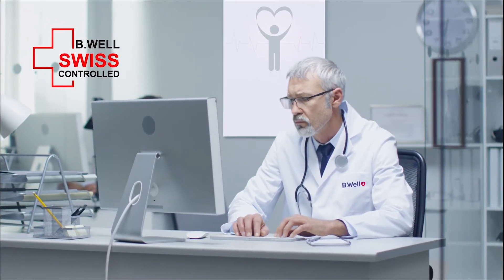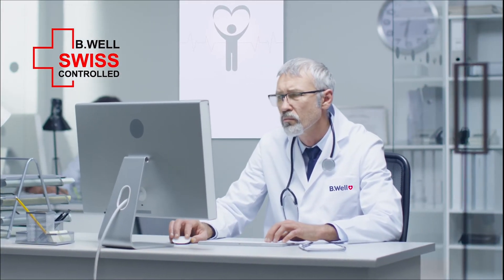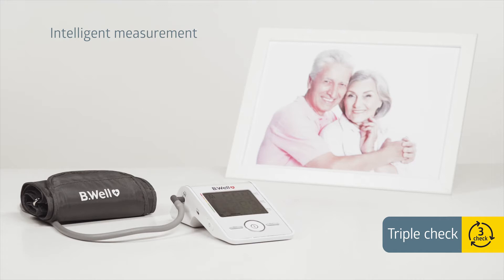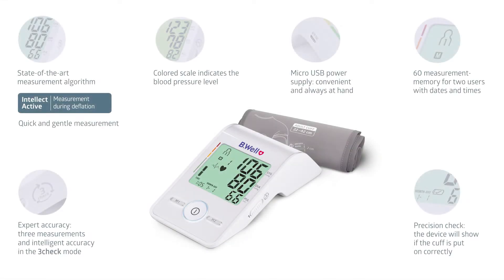Be Well specialists check the accuracy of each monitor 9 times. Be Well tonometers feature unique technologies and advanced features available for everyone. The Be Well Med55 provides advanced accuracy. In the 3-check mode, the device automatically performs 3 consecutive measurements and analyzes results following a special algorithm.